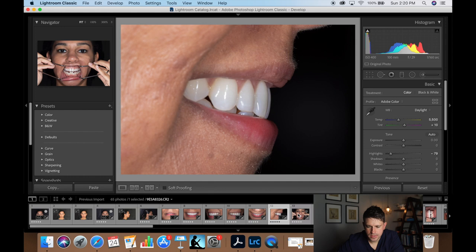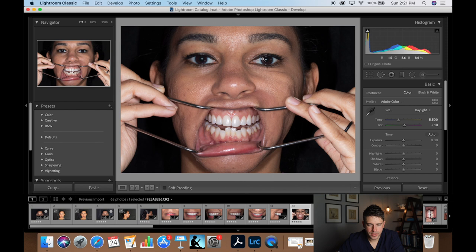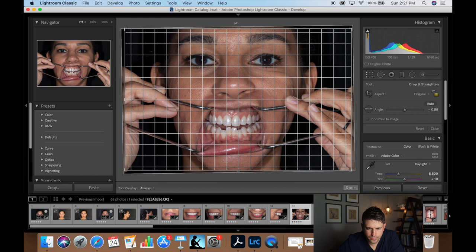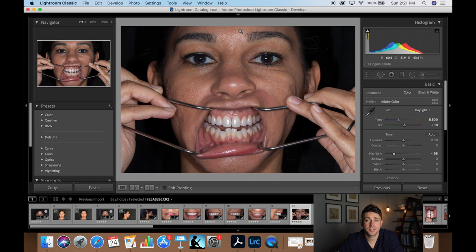Next is our retracted photo — I love this photograph, it tells you so much for treatment planning and diagnosis. Since this is an extra-oral full face photo, I like the eyes to be parallel. The exposure isn't too bad; I'm going to drop the highlights since that's been the trend throughout. Let's check the parallel of the eyes — that looks pretty good, as simple as that.